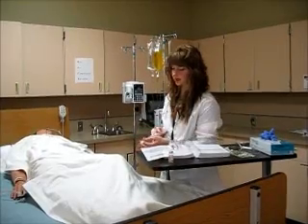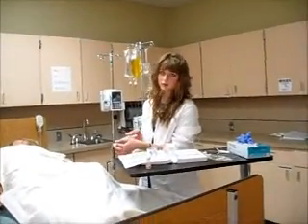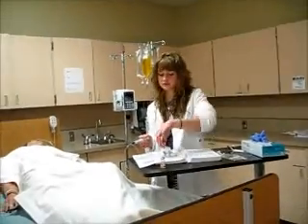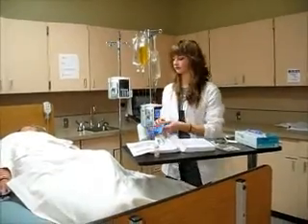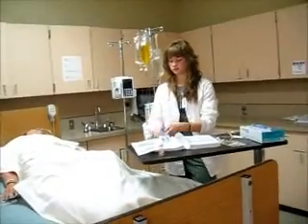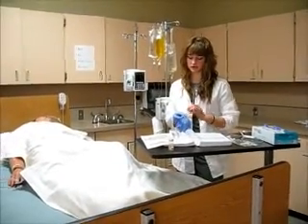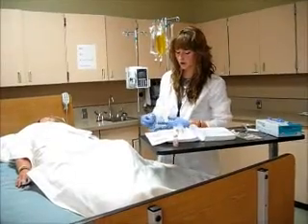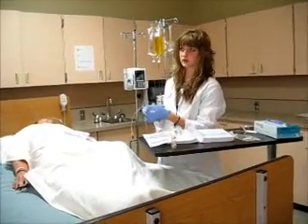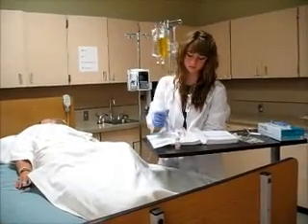And this is my insulin, and I do know that I have to give it over 1 minute. Before I would clean off my port, I would actually put on my gloves. So I'm going to do that real quick. Like I said, I know that I need to give this insulin over 1 minute, so I can give it in increments, and I'm watching the clock over 1 minute. So that's 1 in.